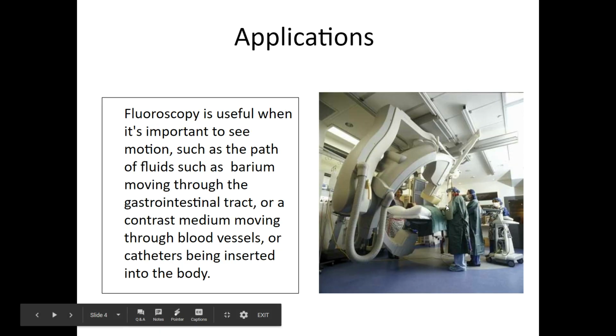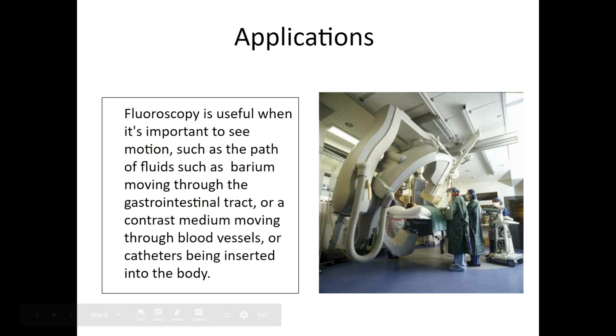So here's an example of fluoroscopy being utilized in an angiographic suite. And this is kind of like a C-arm. It's really cool, but this picture actually belongs in the next lecture.